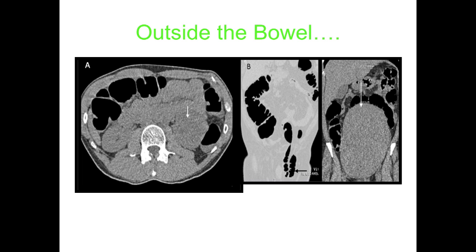Some examples of extra-colonic findings: on the non-contrast low-dose imaging you can see abnormal soft tissue in one area, and on the coronal view there's a huge pelvic mass taking up the entire pelvis and part of the abdomen — this is an ovarian lesion.